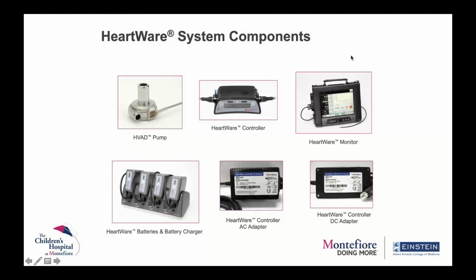Some of the things like the monitor you only see in the hospital. You definitely go home with multiple batteries and battery chargers and your own controllers. And you have to learn how to switch controllers in case of emergencies. You have to learn how to change batteries, charge your batteries, switch from a wall socket to batteries. So those are some of the things, complicated things, that if you do decide to go home, you have to learn.